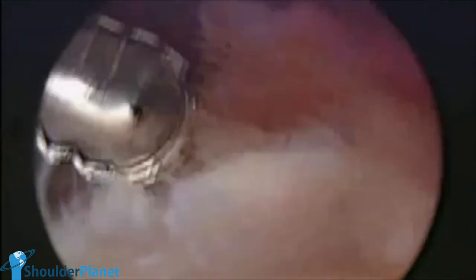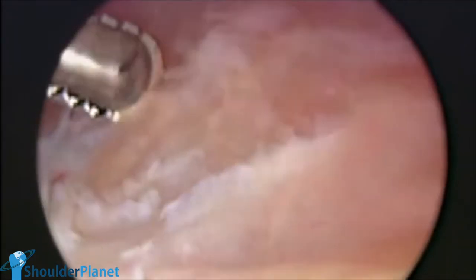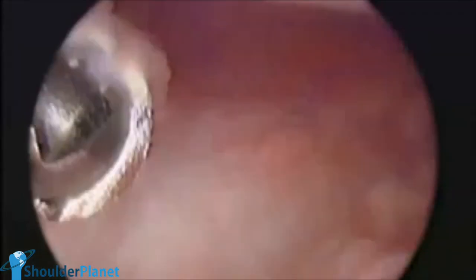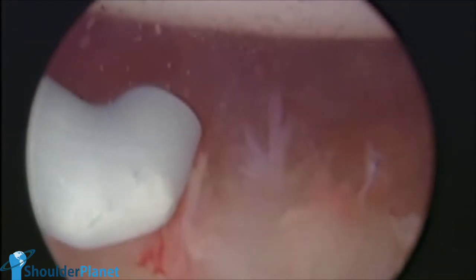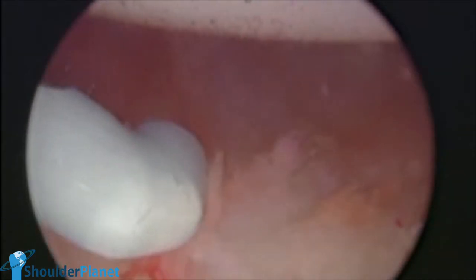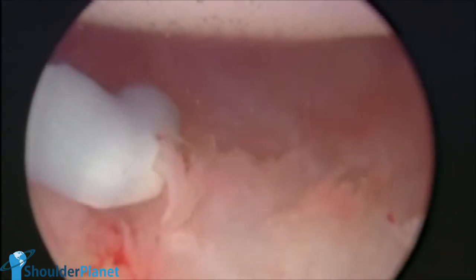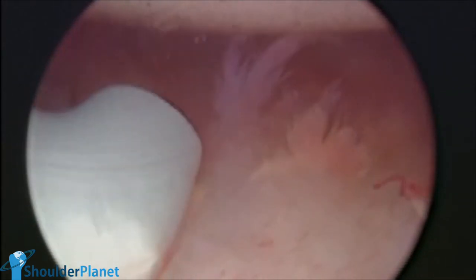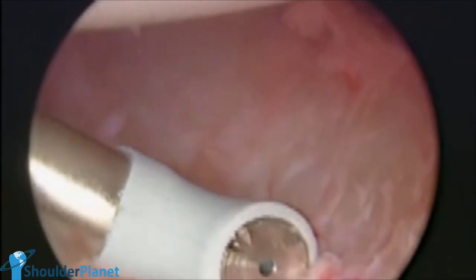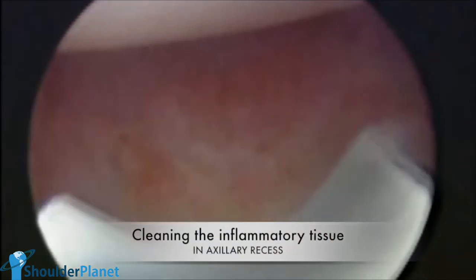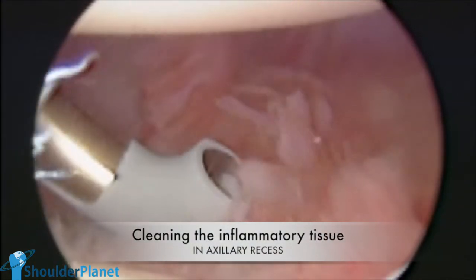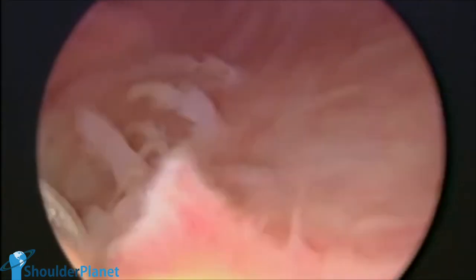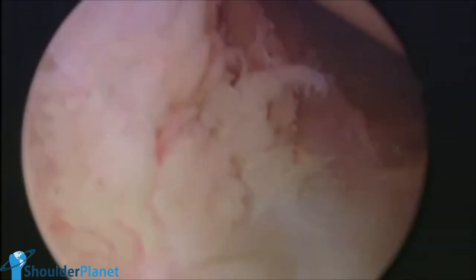We used a Kelly clamp to open the capsule in a very standard way, then we entered with a shaver just to debride the inflammatory tissue and the synovitis in the axillary recess and in the region of the posterior inferior glenohumeral ligament. There was a lot of inflammatory tissue especially because the patient had dislocated his shoulder 15 days before the surgery. So we would have to remove all the synovitis and all the inflammatory tissue in the axillary recess. We continued that with a radiofrequency device, removing all the synovitis and inflammatory tissue, in order to find the HAGL lesion more easily.